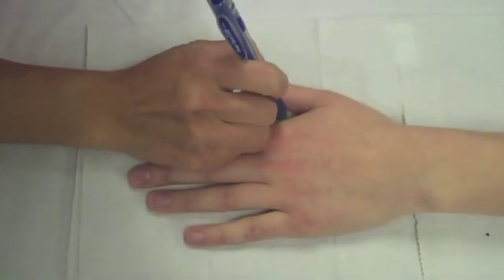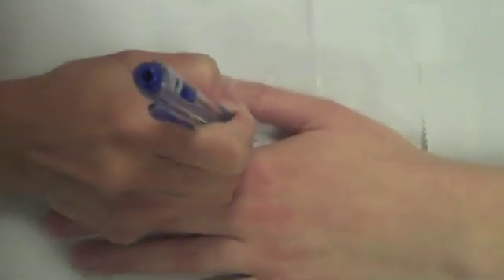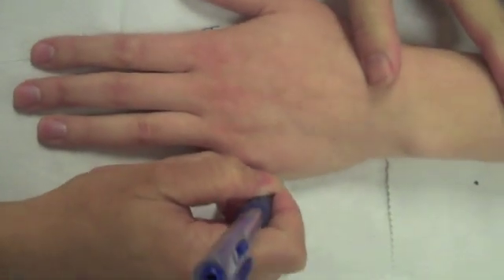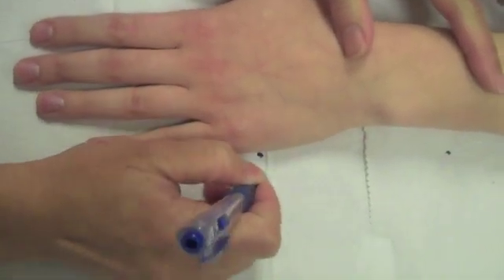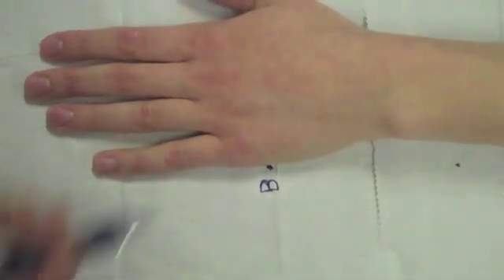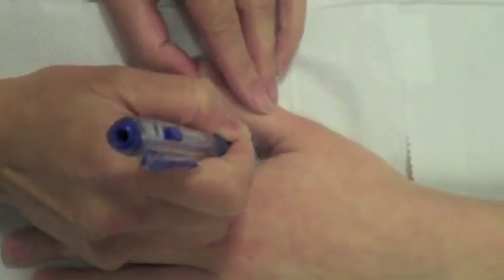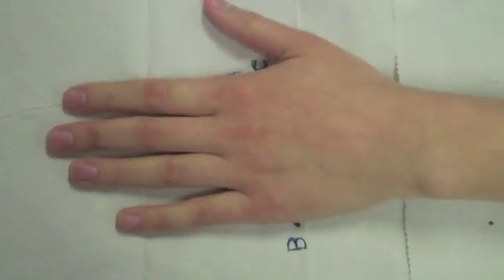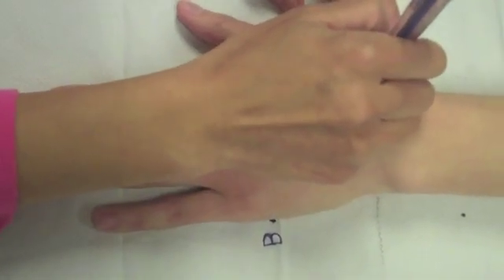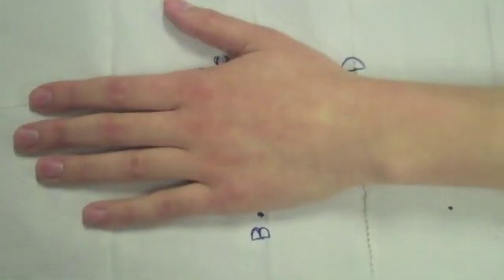Have the patient place their hand, palm down, on a flat surface. Mark an A by the second MCP joint. Mark a B by the fifth MCP joint. Mark a C by the first webspace. Then mark a D near the base of the thumb at the CMC joint.